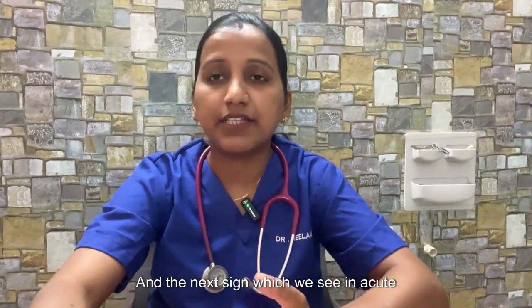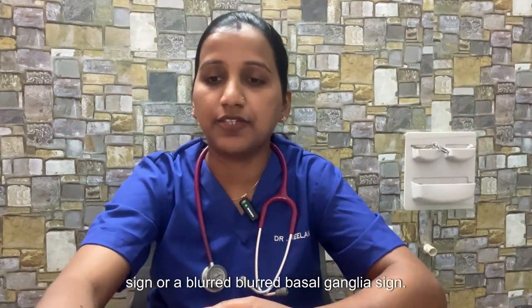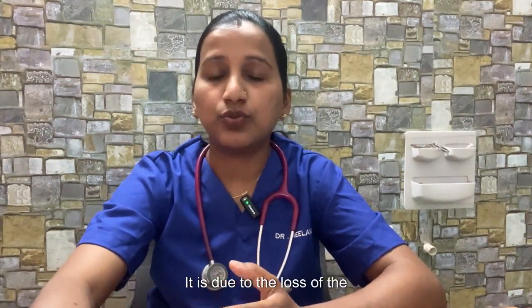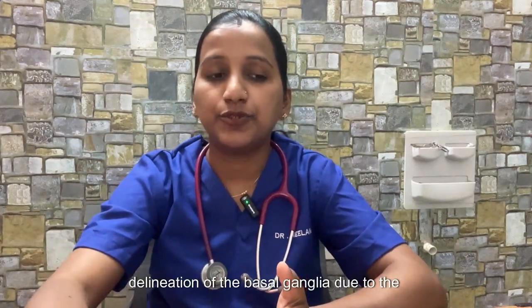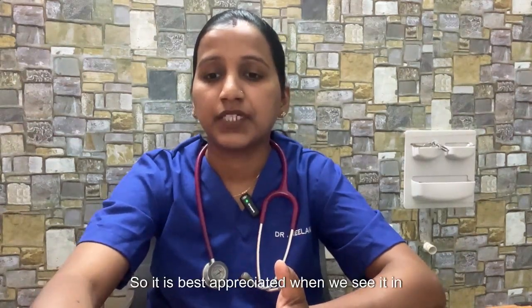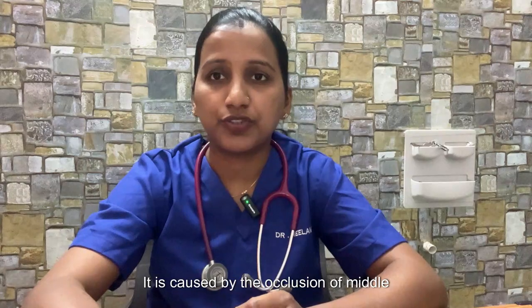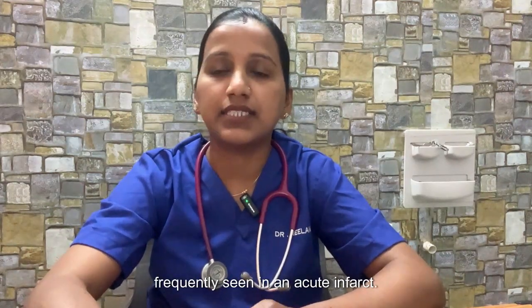And the next sign which we see in an acute stroke is the disappearing basal ganglia sign or a blurred basal ganglia sign. It is basically seen in an acute infarction. It is due to the loss of the delineation of the basal ganglia due to the blurring of the gray-white matter interface. So it is best appreciated when we see it in comparison to the contralateral side. It is caused by the occlusion of middle cerebral artery. This is the earliest sign and most frequently seen in an acute infarct.